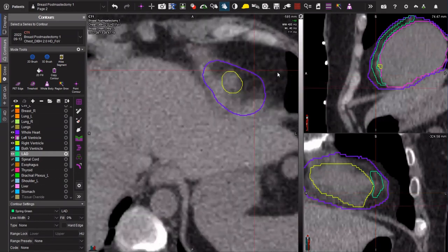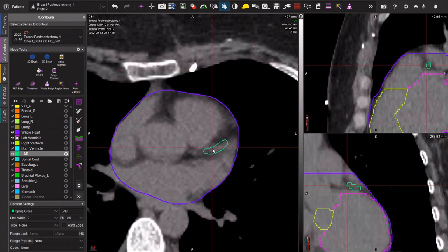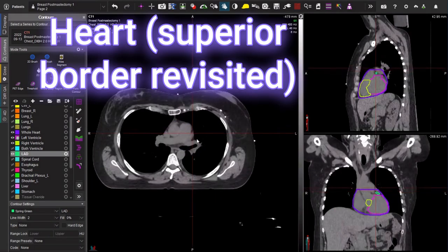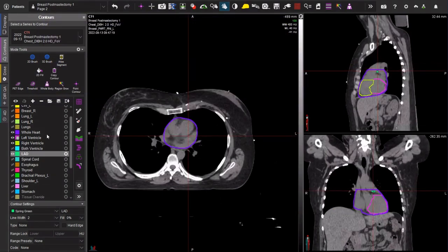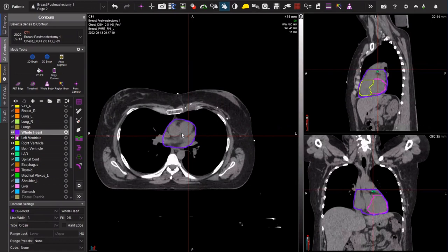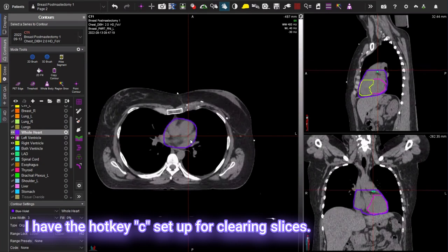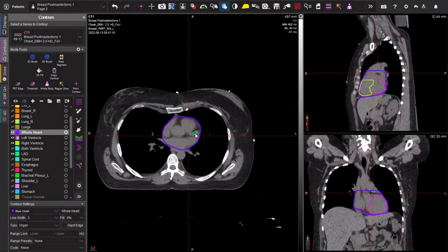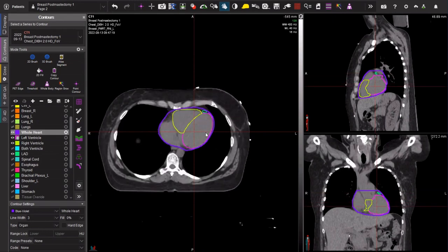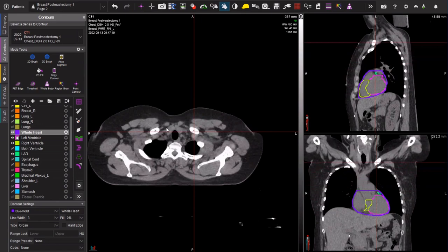That's how you draw the LAD, and let's get back to the superior border of the heart. Essentially I'm looking for where does my LAD start — that's usually what guides me to choose the top slice of my heart. In this case I might edit the heart just a little bit, take out this slice maybe even take out this slice, and then this is where my LAD starts. I just want to make sure that I am protecting it safely.